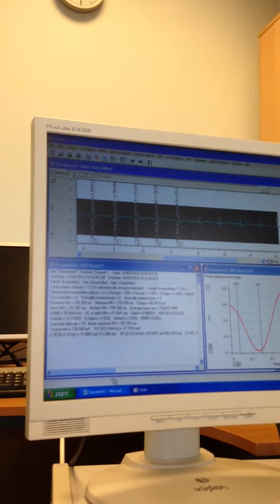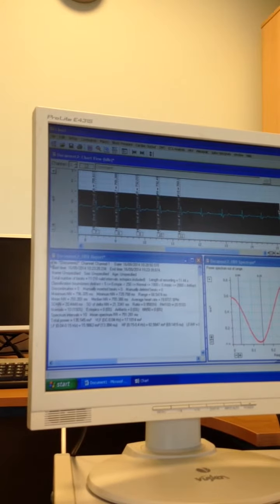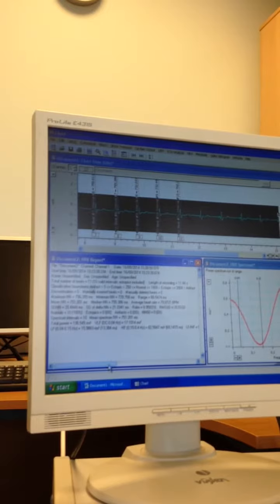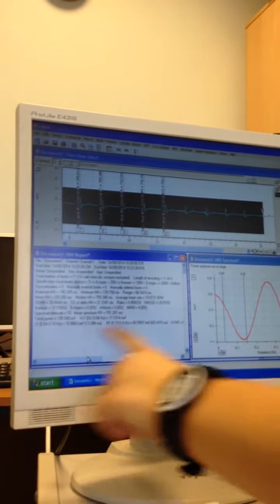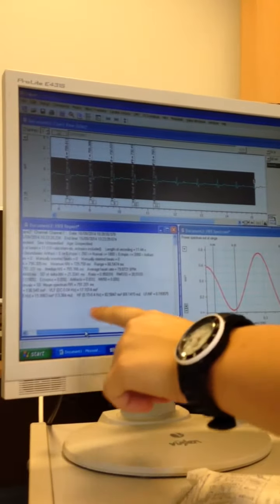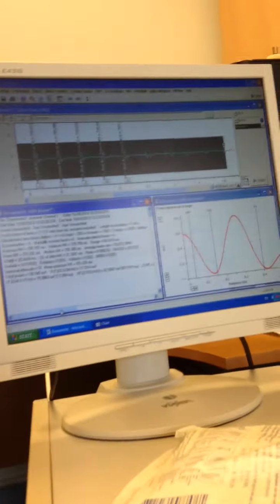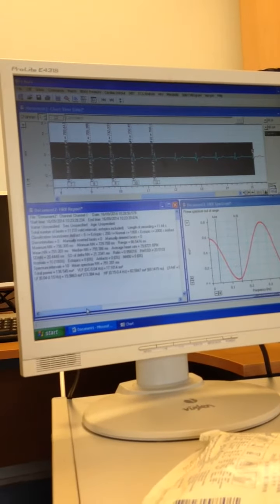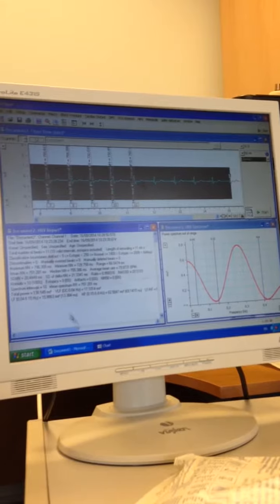Yeah. Now, when you minimize it, this is pretty much all you need to know. All of this stuff here. So you have your high frequency, low frequency, LF to HF ratio. You'll learn about these. Yeah, I definitely need to learn more about these as well, actually. Essentially, when you're doing HRV, the 3 things you're looking at are low frequency, high frequency, and the LF to HF ratio. Okay, yeah. So these are the most important.